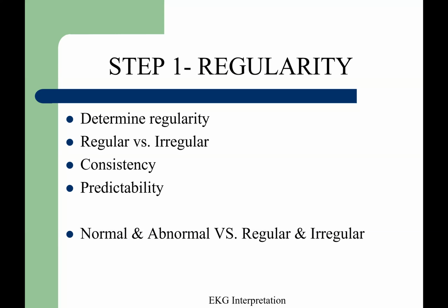Okay, so that information was extremely important because we're going to start seeing different types of strips, different types of EKG beats, and we're going to need to be able to determine what kind they are. So it's important to understand those different cells, from either the sinus node, the atrium, the junction, or the ventricles. They have different rates at which they will fire, and they will pick up at different times based on the failure of the higher order cells. We're going to determine some of the criteria that need to be met in the next chapter.